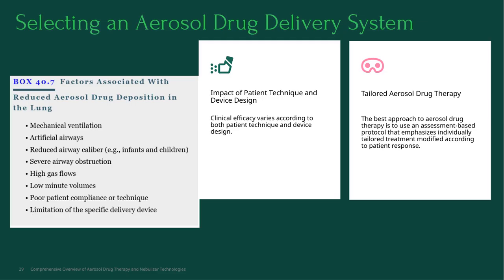Let's talk about the impact of patient technique and device design. As we've seen, clinical efficacy can really vary depending on how the patient uses the device and the specific design features of that device. It's crucial to recognize that even the most advanced nebulizer won't work optimally if the technique isn't correct. Now, when it comes to tailoring aerosol drug therapy, the key is to adopt an assessment-based protocol.